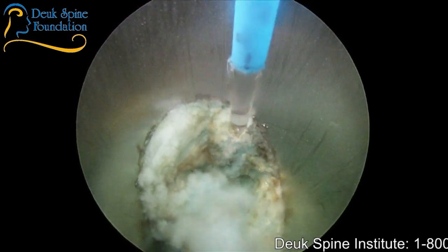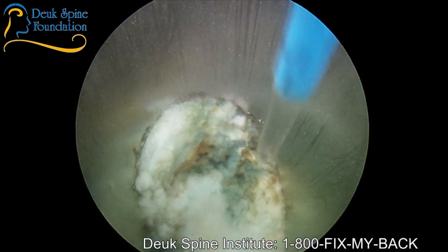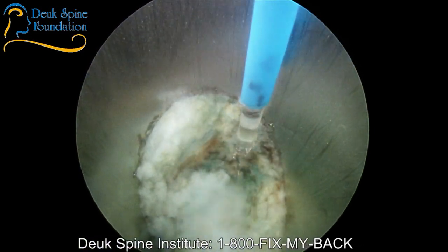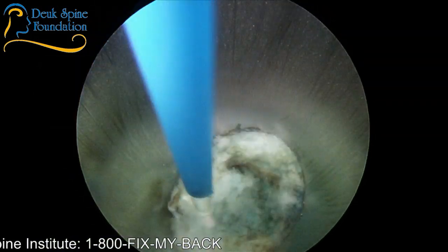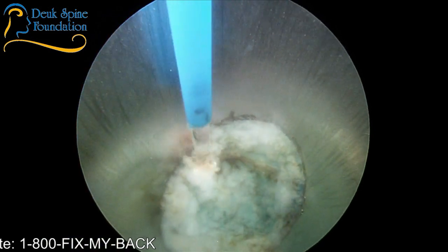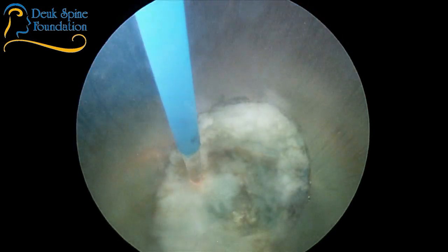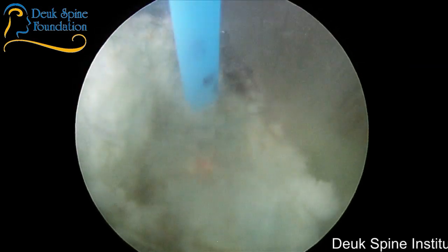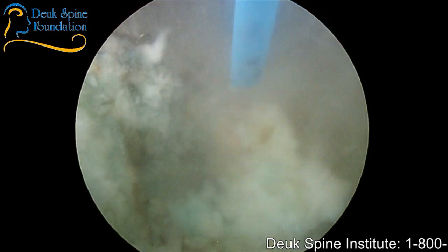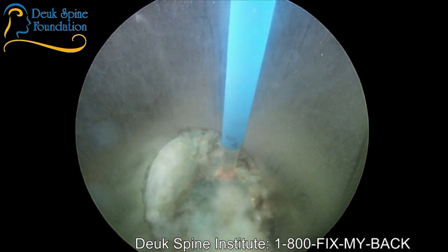And you're looking through a tube, a small metal tube. Those are the metal walls on the side. It's like being inside of a straw, a metal straw. I always use the McDonald's shake straw. That's about the width of a McDonald's shake straw, or any shake straw. So we're inside the straw. The straw goes from the outside where I'm standing, all the way through the body and into the disc herniation specifically. It literally enters the disc right where the herniation is, in the foramen and lateral recess. So that's what we're looking at. Now this area here is a bit more scarred up.